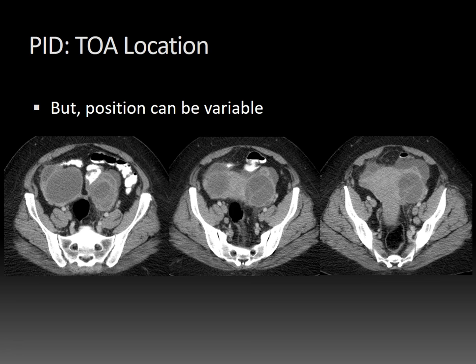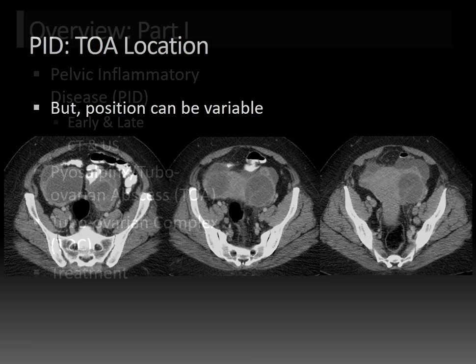However, the tubovarian abscess location can be variable. In this patient, there are bilateral anterior complex fluid collections or masses in the adnexa. One might originally consider that these could represent cystic ovarian neoplasms given their location, but these did turn out to be bilateral tubovarian abscesses. You can also see some mild fat stranding in the pelvis, which is a clue.